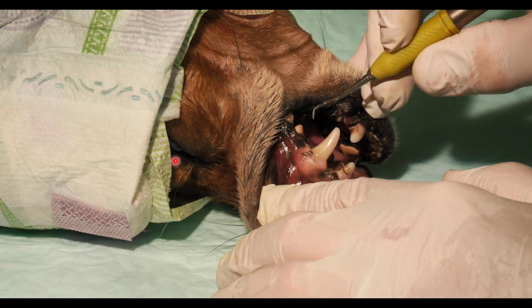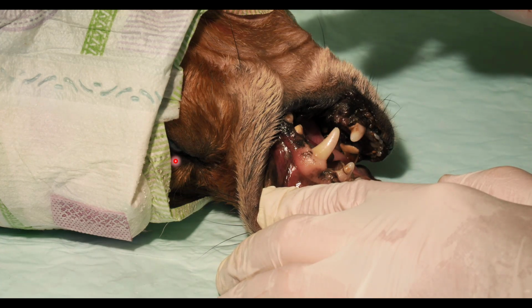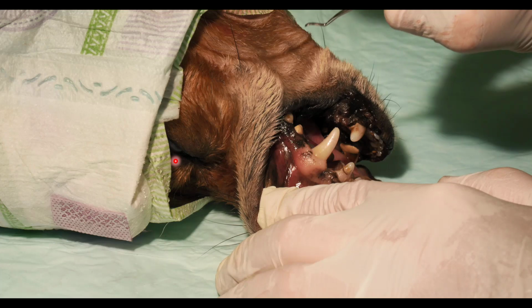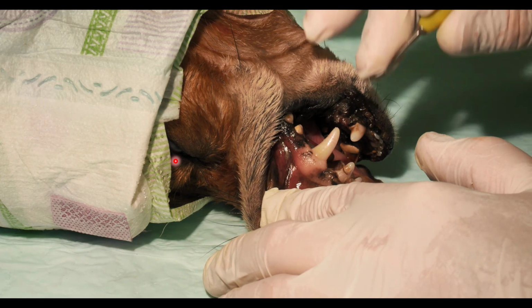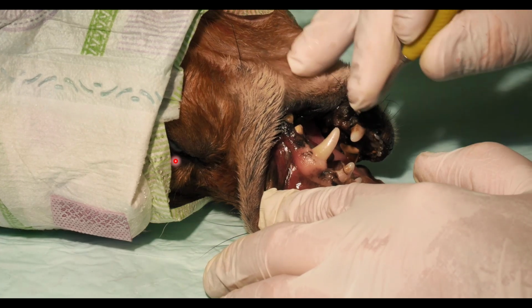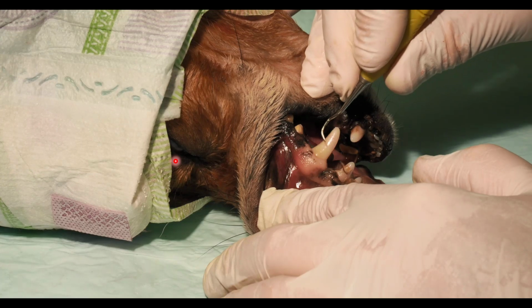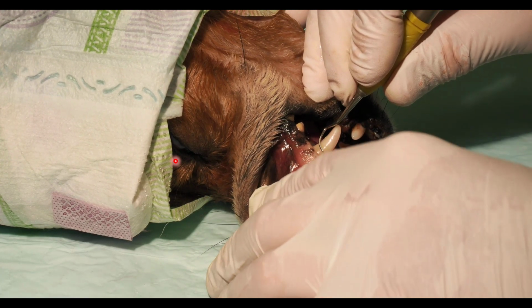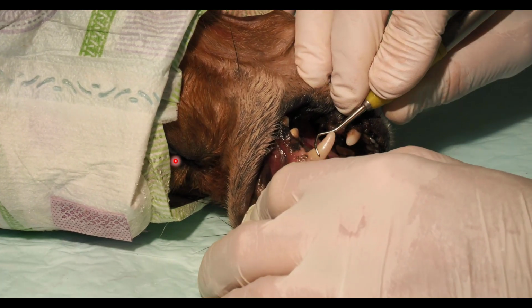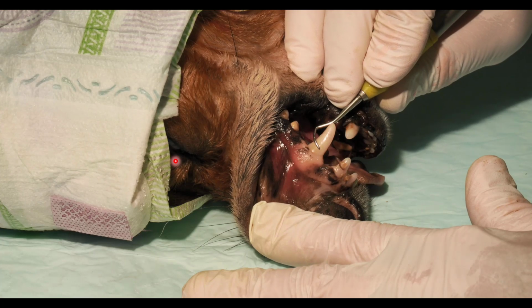So what you want to do, get your modified pencil grip again. Remember, your middle finger should go right on top of the shank, your thumb and your index finger, just the tips there, and then rest on the dog. Pet the dog. He wants to be petted while you're doing your work, okay? Rest on something. Then start with the shank parallel to the tooth, then rotate the instrument down to decrease the profile, okay? So you're bringing the profile down like that.